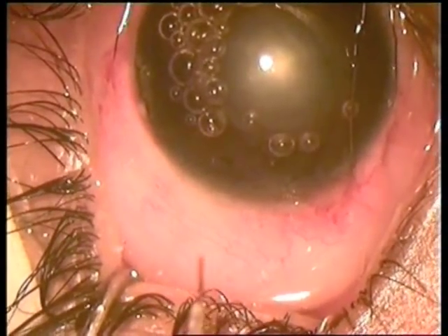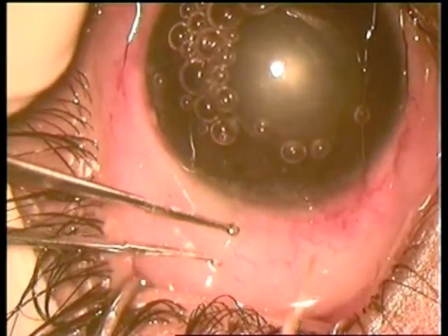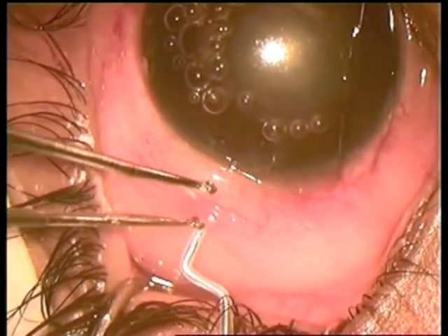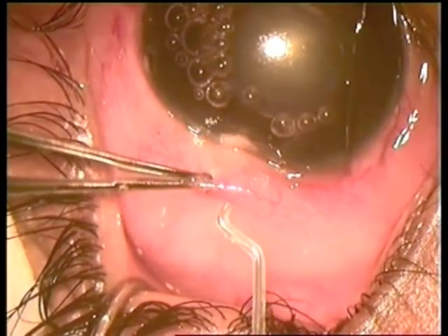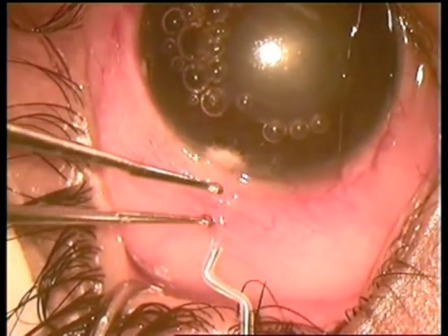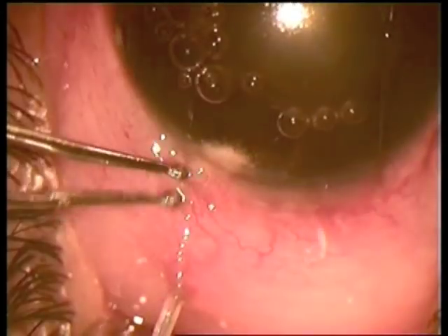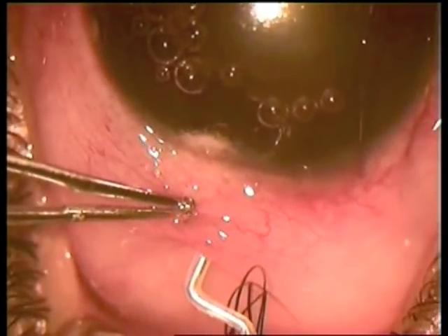Time for microtrack filtration using the 100-micron tip of the Fugoblade. Lift the conjunctiva, go through the conjunctiva, reach the limbus, and with full energy get into the anterior chamber. There is Helon inside, so there is no leakage of aqueous.